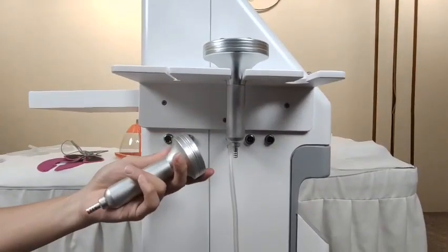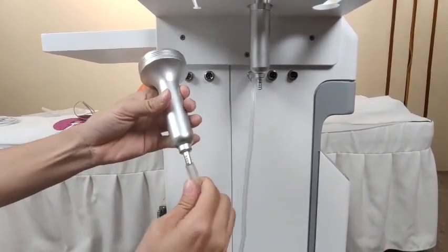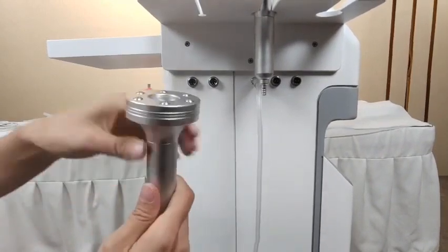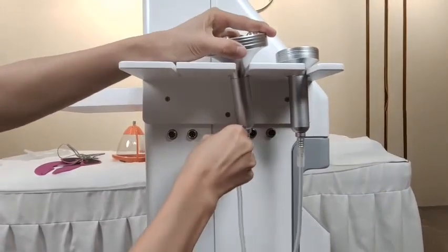This one is the vacuum massage working handle. We need to put this tube on this side of the working handle, and then insert the other side into this part.